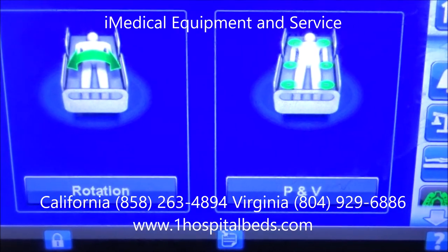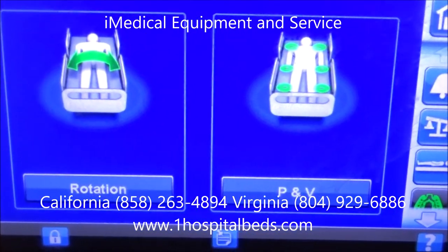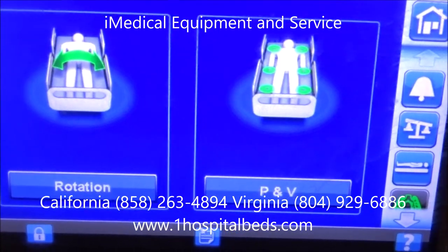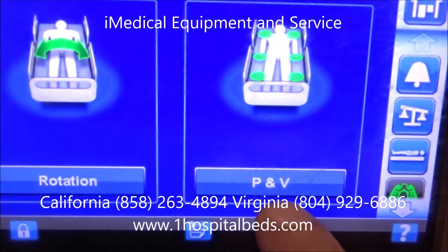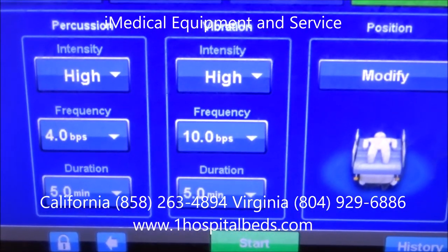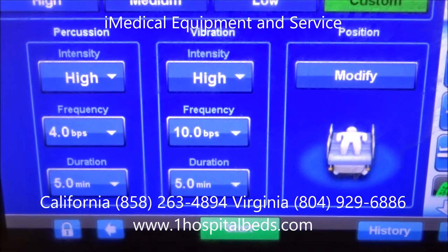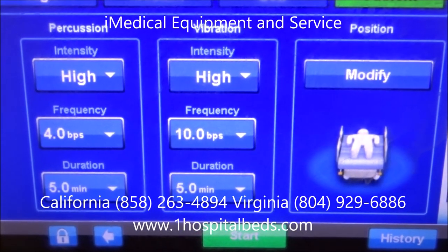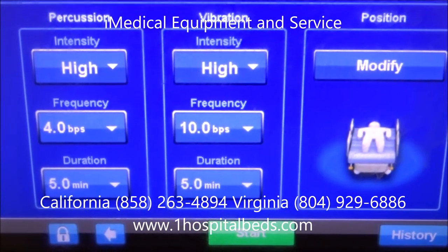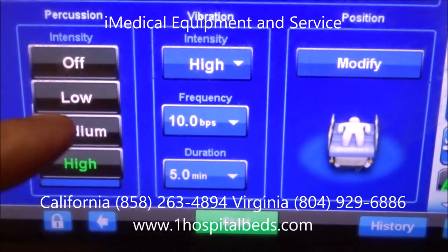The rotation feature also helps turn the person throughout the night, which is a great feature, but these are two of the features this mattress offers that are absolutely phenomenal. For the P and V — percussion and vibration — I've put it on a high setting since we don't have a person in the bed and I'm using a footboard as a demo. You can see it's very easy: you've got low, medium, and high settings, and I've got it on high.